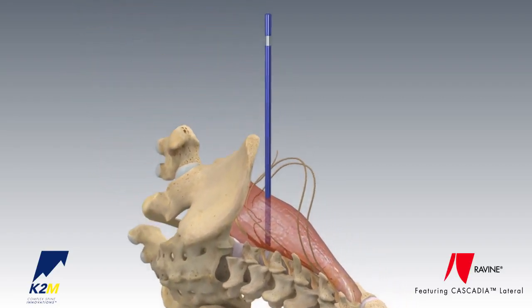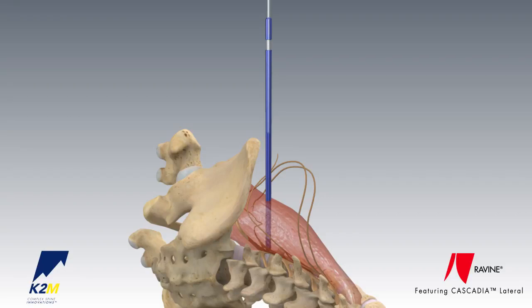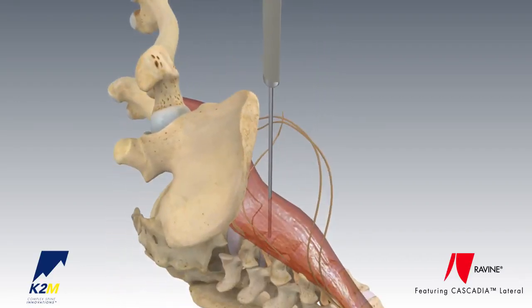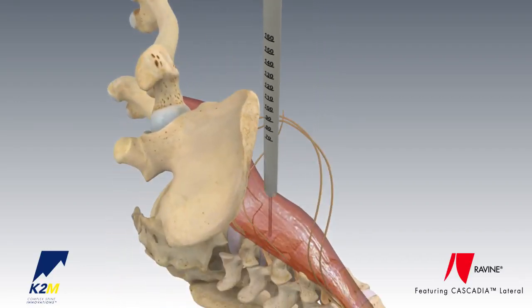Next, the intradiscal guide wire is placed through the 6 mm dissector and advanced into the disc. To achieve greater soft tissue dilation, the initial dissector is removed, leaving the guide wire in place. Then the larger dissectors, 14 and 24 mm, are introduced over the guide wire and advanced into the pathway already safely established, keeping in line with the muscle fibers of the psoas and safely anterior to the lumbar plexus.